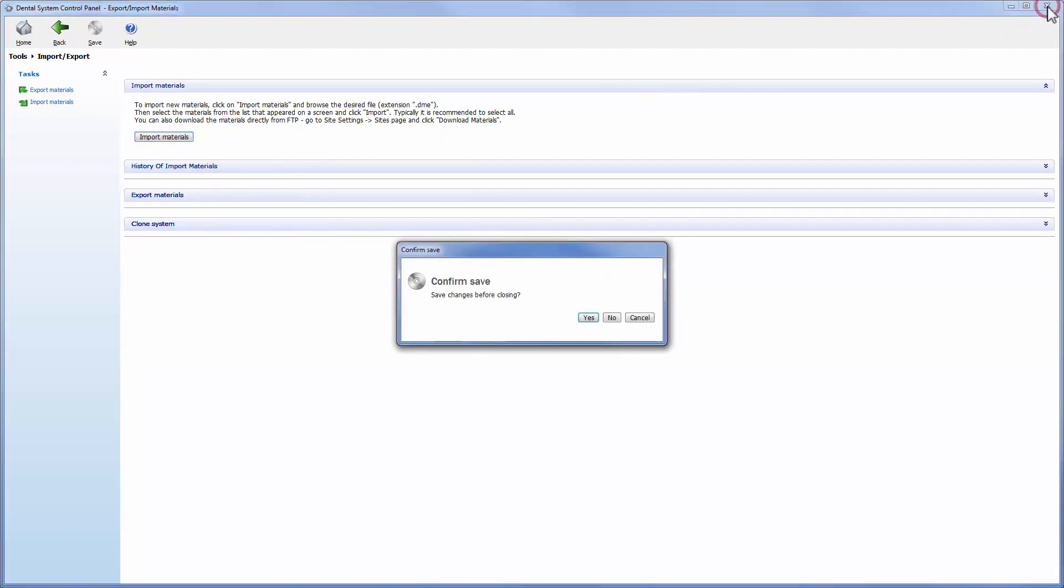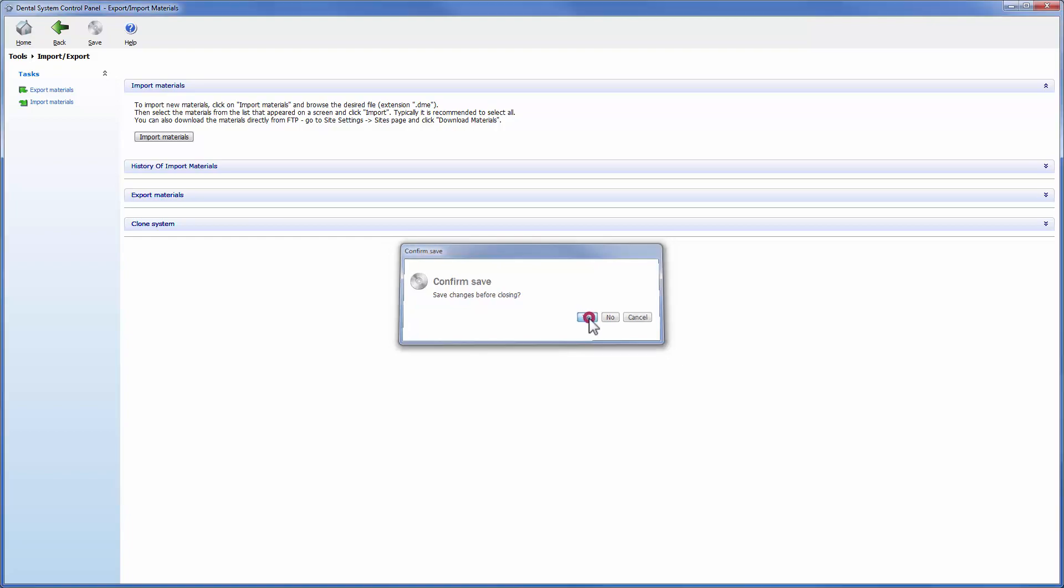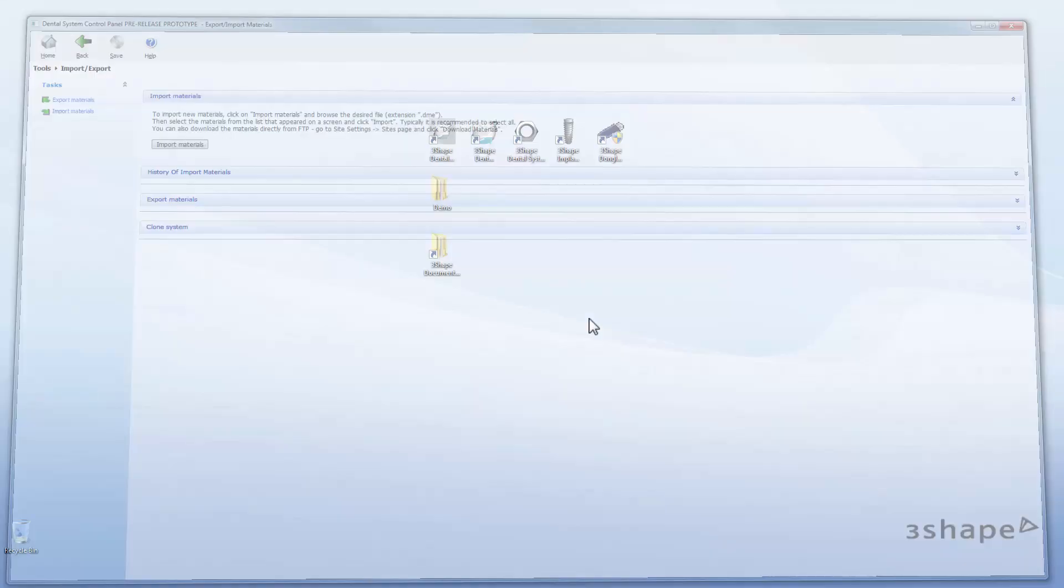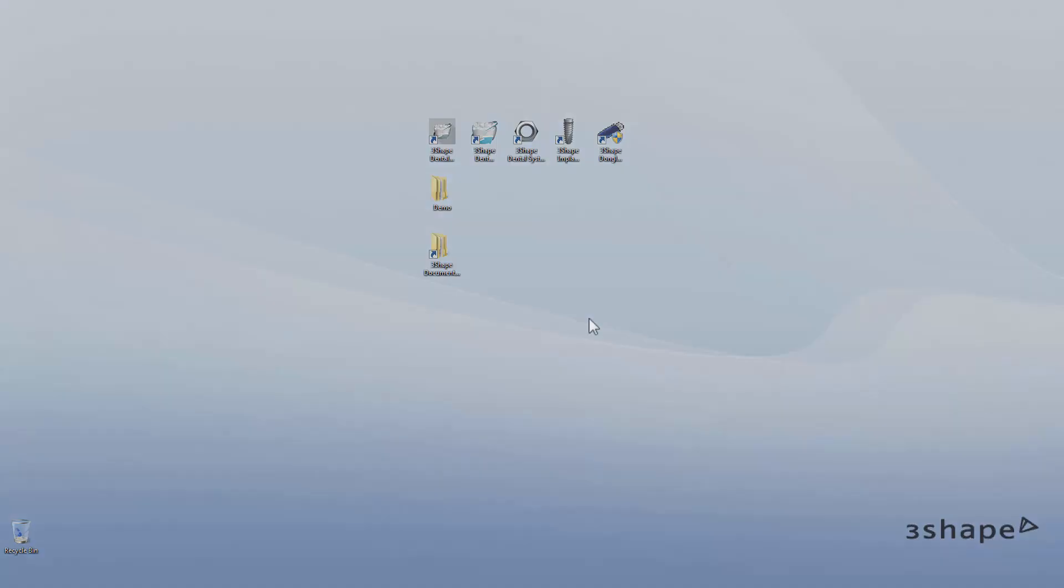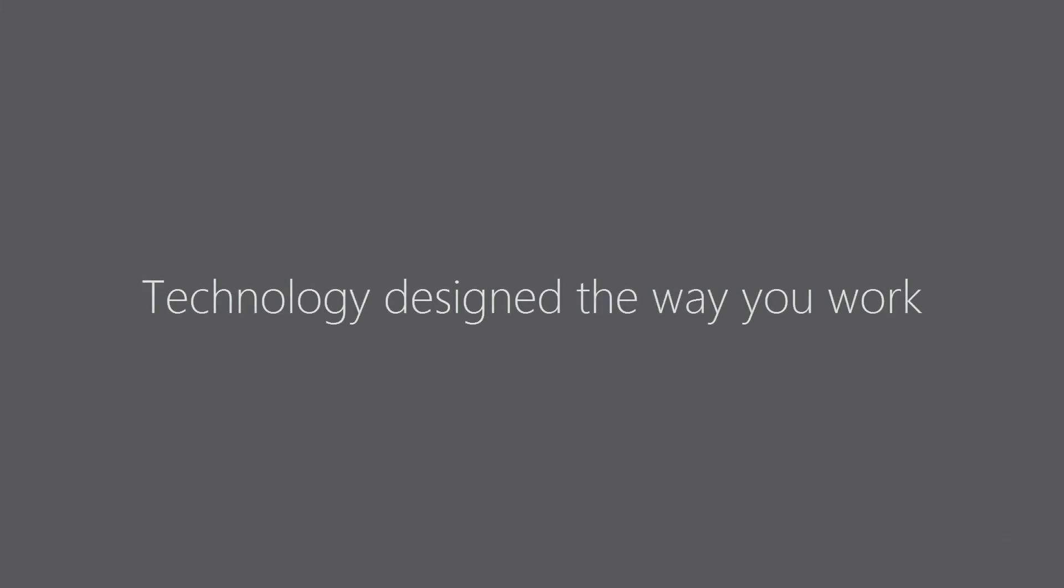Then close the control panel to save the changes. And that's it.